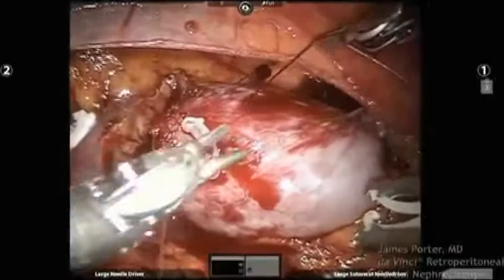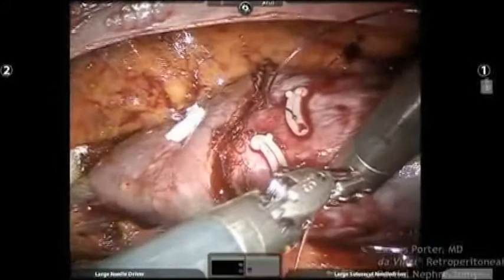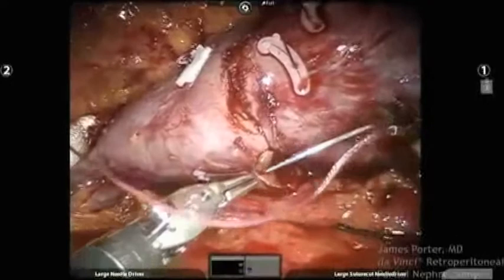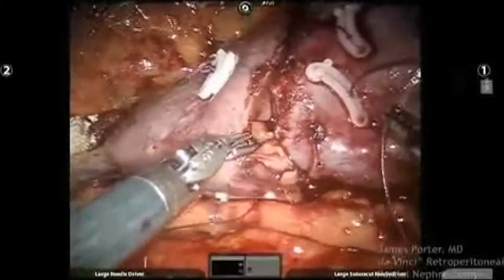Question from the audience? I haven't. I know there are a group of about three or four people that have some experience with this, and they're using the Habib around the margin of the tumor and then resecting the lesion without clamping. I think it's a neat concept, but I think we're turning a very expensive operation into an even more expensive operation. And I think there's concern also of the thermal damage and perhaps charring that margin, making it more difficult to discern the adequacy of your resection. But in saying that, I have not had any direct experience with that myself.